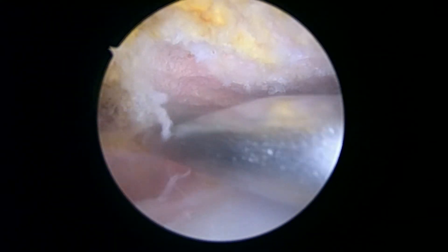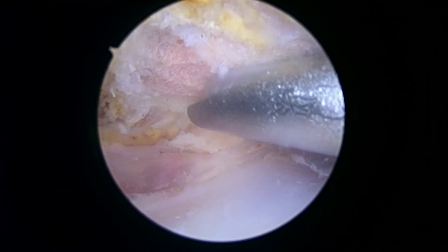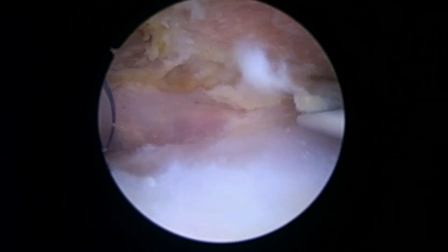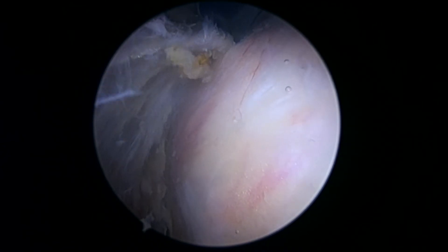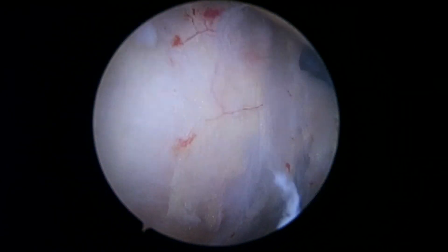You did have a pretty thickened coracoacromial ligament — we've already removed it. And now we're getting a pretty good look; there's plenty of space here. Your clavicle is over there, we'll deal with that in a minute. But as we look down at the rotator cuff below and rotate your shoulder, it looks just great. This is the posterior part of the cuff as we internally rotate, and then as we externally rotate, that's the anterior part of the cuff. Even when we look all the way back here towards the infraspinatus, that looks good. No signs of any problems in the cuff.